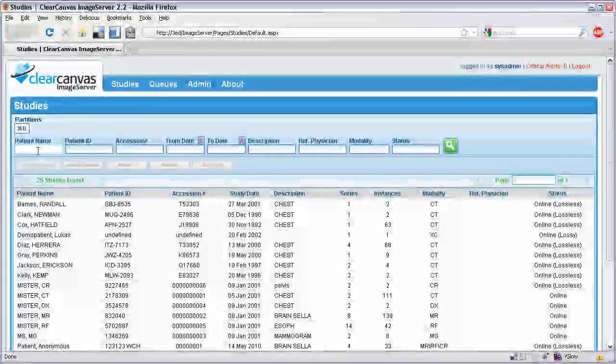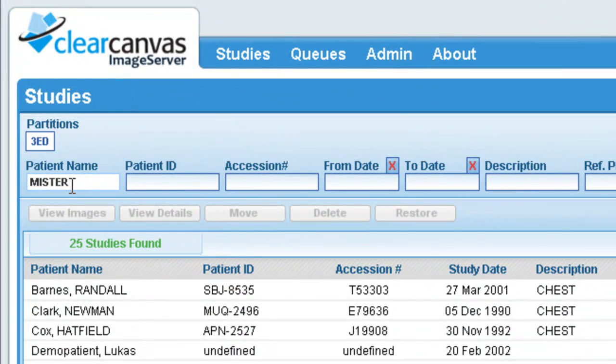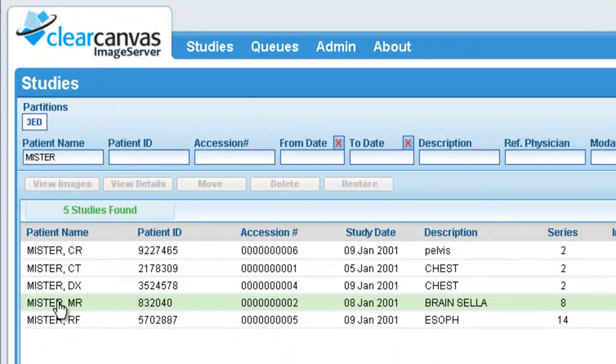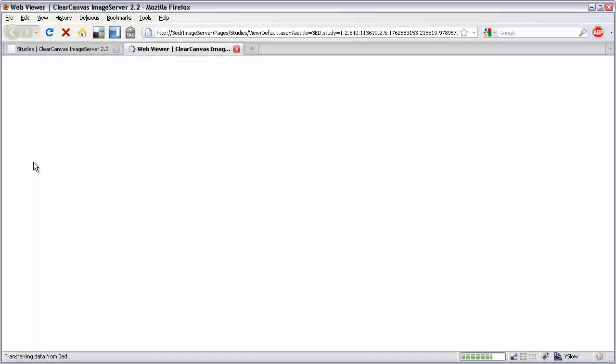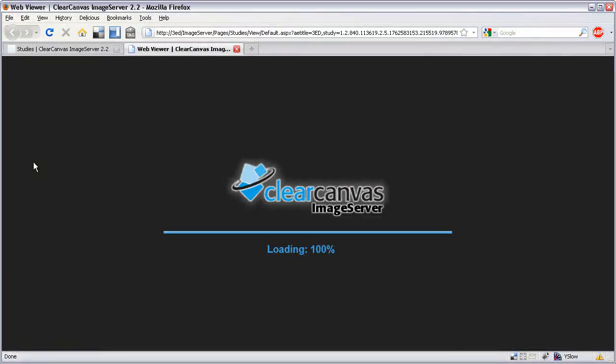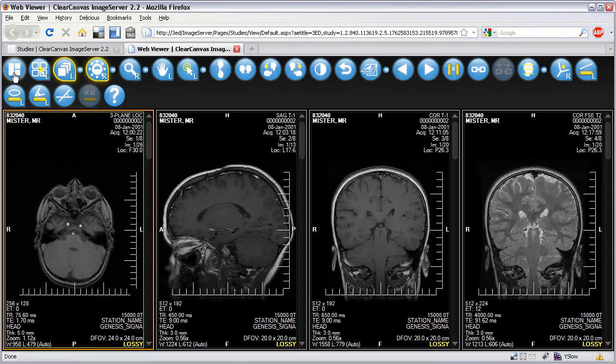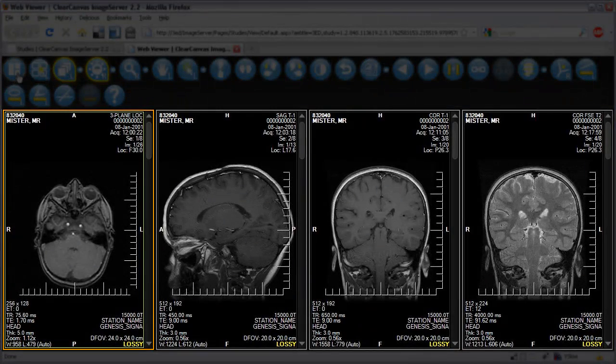To use the ClearCanvas webstation, simply log in to the ClearCanvas image server and search for the studies you want to view. Select the desired studies and then click on the View Images button. The ClearCanvas webstation will open in a new browser window with the selected studies loaded.